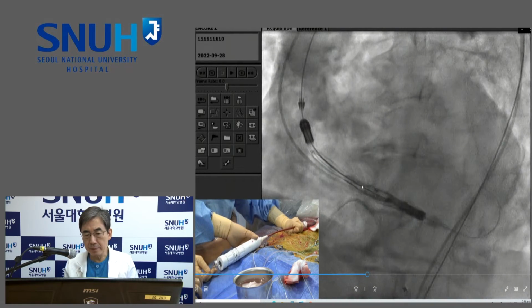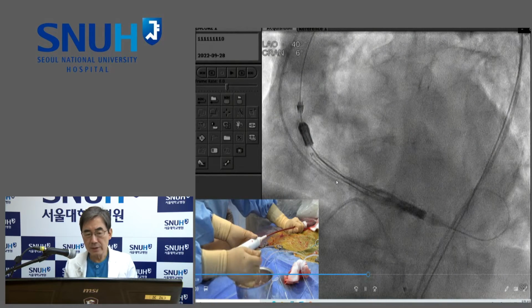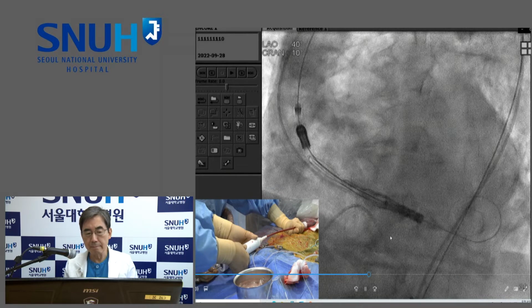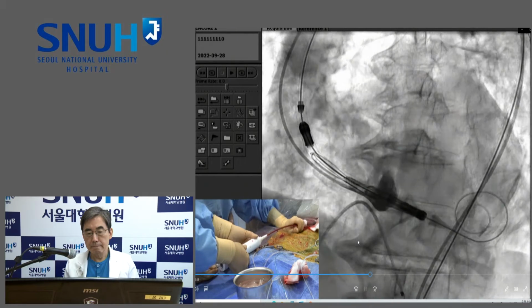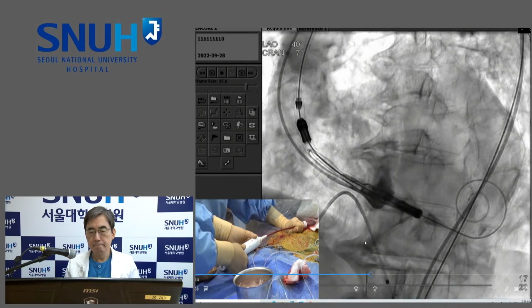Here is the upper crown, first step, stabilization arch, second step. Here is the low crown, third step. It is interesting that the release of the valve starts from the top and ends at the bottom, the opposite direction compared to a core valve.